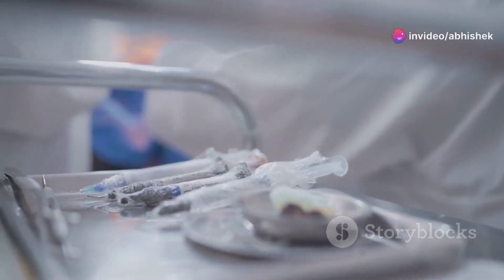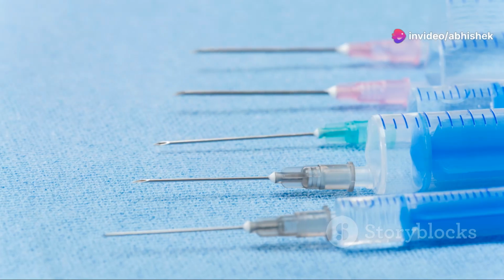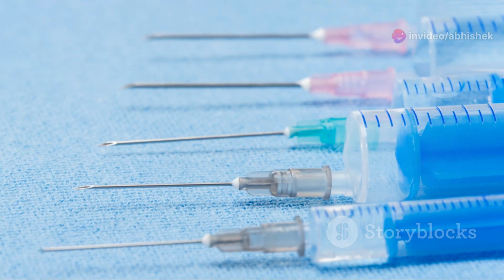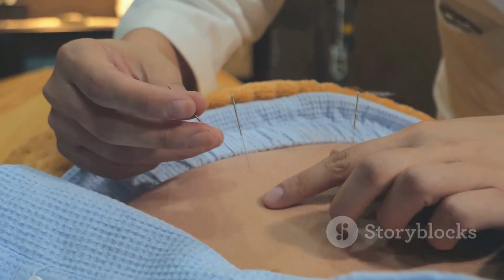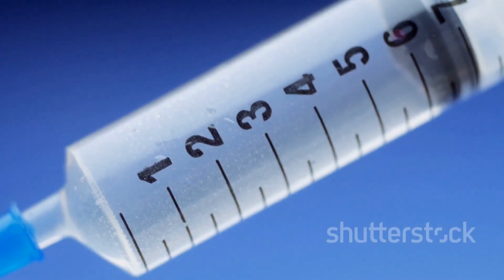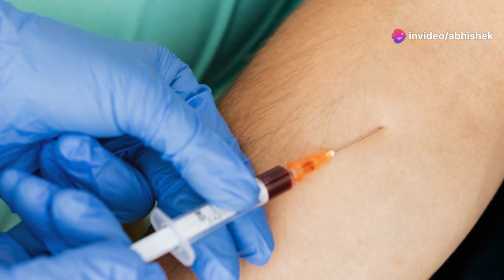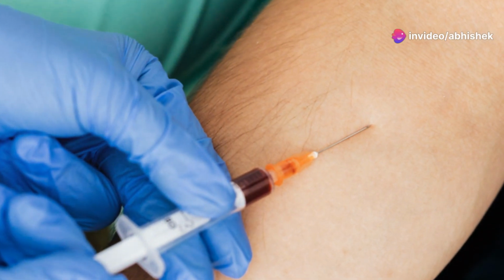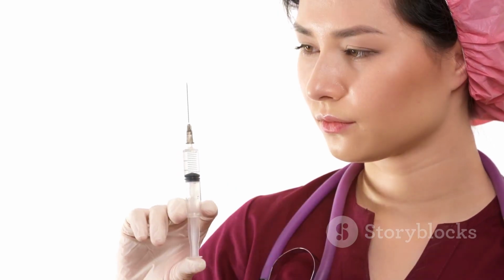Needles, gauges, and lengths. Needles are attached to syringes to deliver medication. They come in different gauges and lengths. Gauge refers to the needle's diameter. A higher gauge number indicates a thinner needle. Length is measured in inches or millimeters. The needle length depends on the injection type and the patient's size. Choosing the appropriate needle gauge and length is crucial for patient comfort and safety.